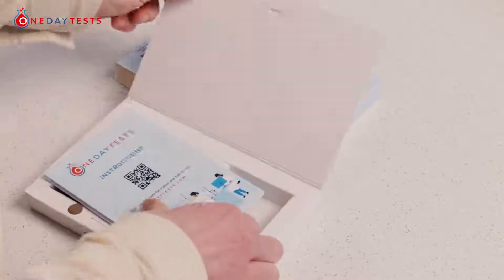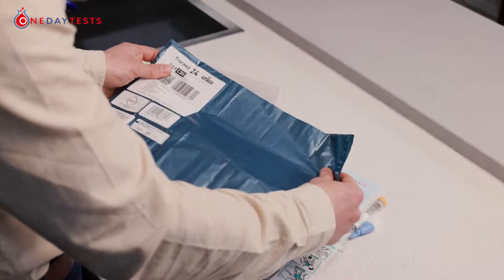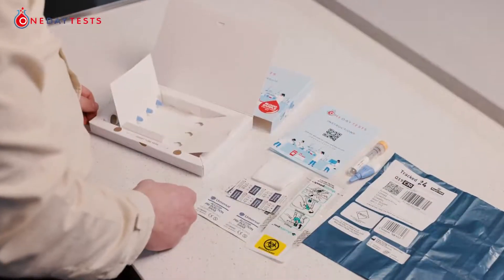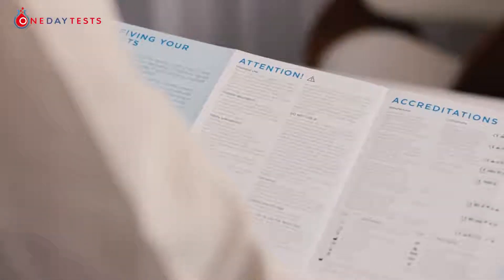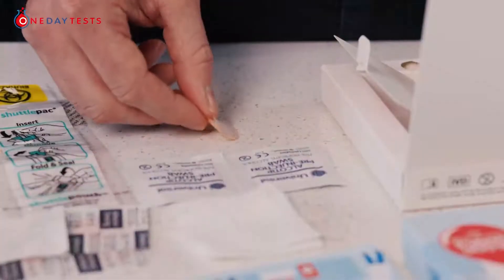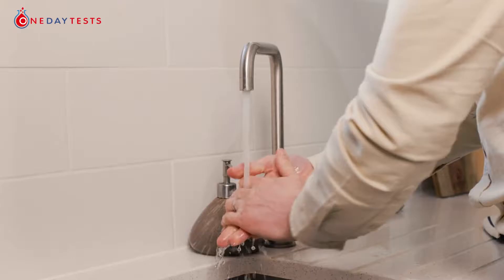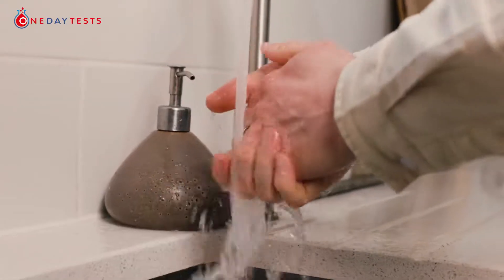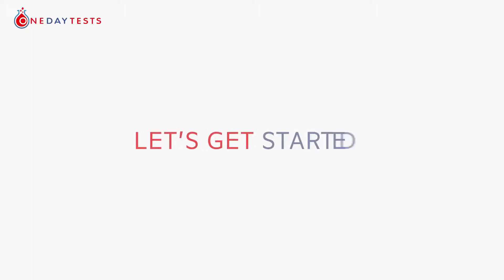Prepare your kit by taking the contents out of the box and laying them out on the table. First of all, read your kit's instructions in full, very carefully, including warnings. Open up your plaster in advance and allow plenty of room. Warm up and wash your hands — soak your hands in warm water for at least four minutes just before you start, then dry your hands thoroughly. Now you're ready — let's start.